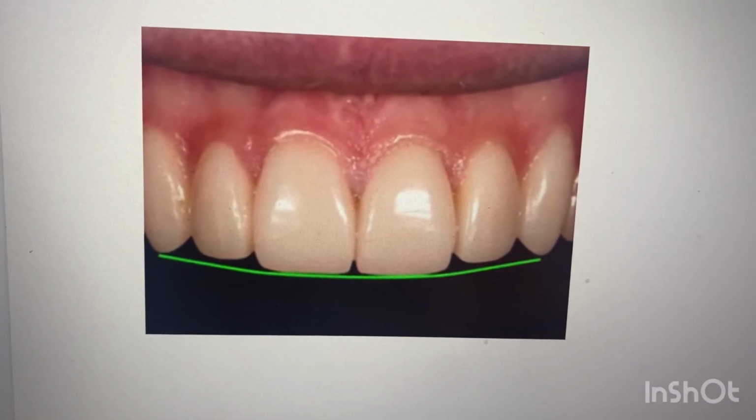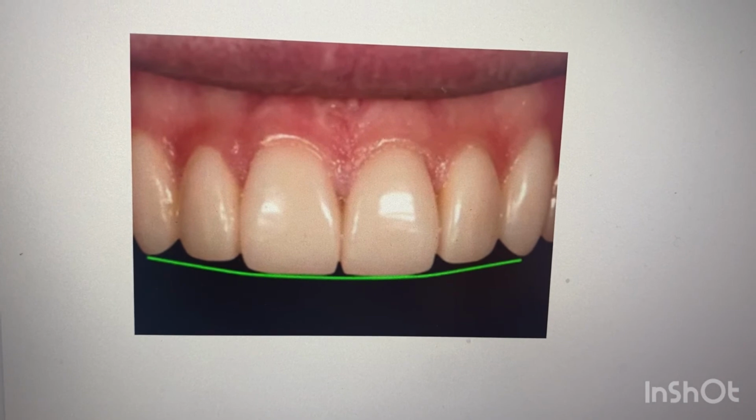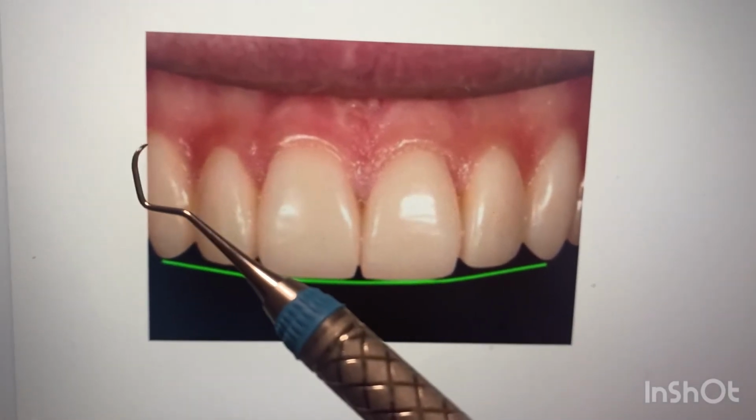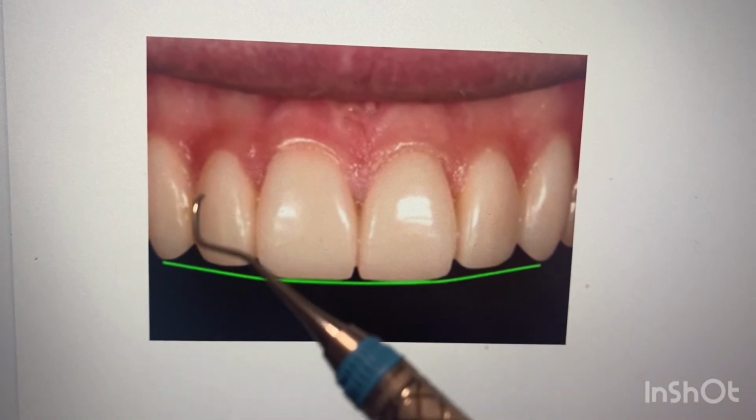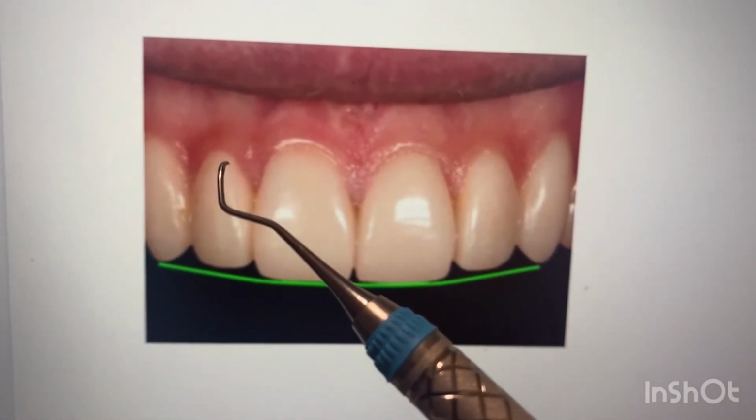At a 12 o'clock position, we are going to do the same technique starting from the midline of the canine, but this time we are going to work on surfaces away from us.